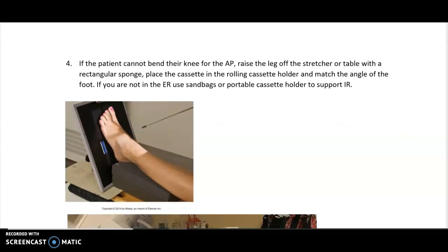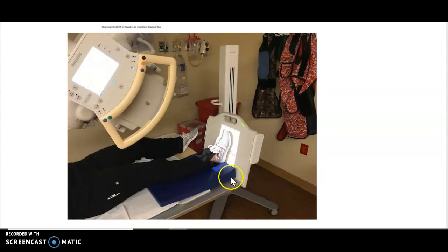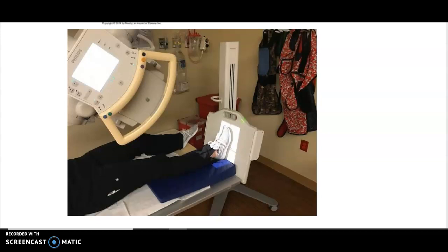If they can't bend their knee at all, you have to raise the leg up off the stretcher. Use those blue rectangle sponges — the kind used for stretcher chest positioning — to raise the leg, keeping the sponges flush to their heel. Then use either the rolling cassette holder available in the ER, or sandbags and a cassette with tape to hold it in place. Angle the cassette to the patient and bring it slightly below the foot. Make sure the patient is supine and not sitting up, otherwise the tube will be right in front of their face. Angle the tube to the foot, bring the cassette as flush to the foot as you can, and watch your SID — don't be too far away.